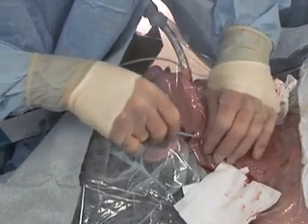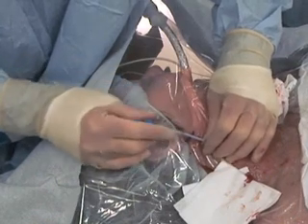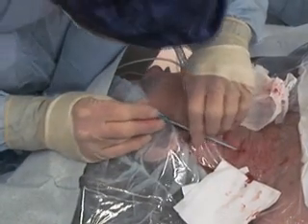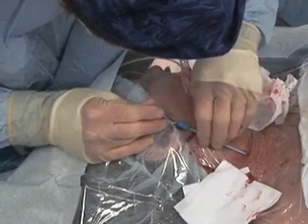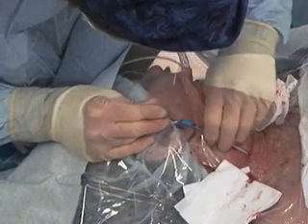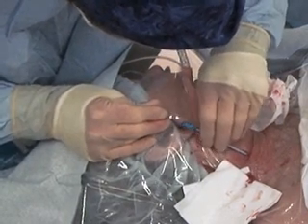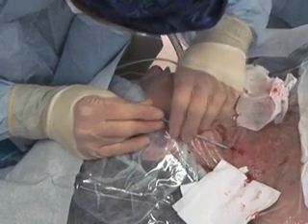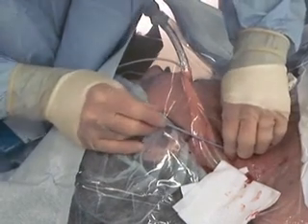Place the dilator over the guide wire, being certain to maintain control of the wire at all times in order to prevent a wire embolism, and advance the dilator 1 to 2 centimeters by holding it close to the tip and rotating it. Be careful not to introduce a bend or kink in the guide wire.